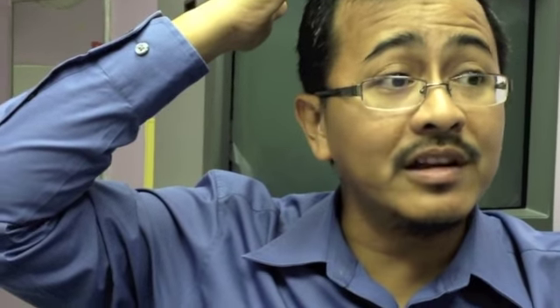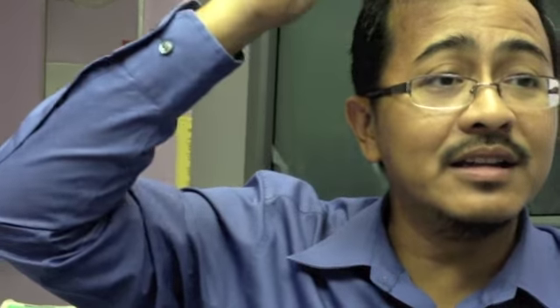Regular or irregular. This will decide whether the teacher, the husband, the mother, the parents gonna get sued. You decide. You see, there's a perforation and it is jagged. I believe this is a traumatic perforation. Then the teacher will get sued. You understand or not?